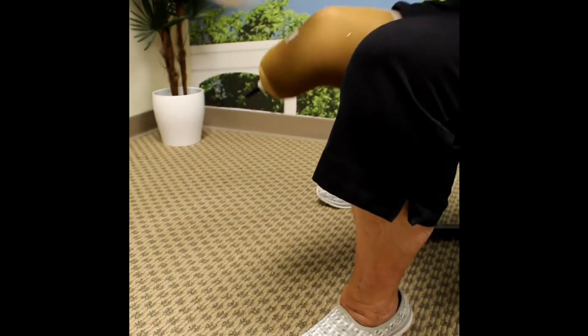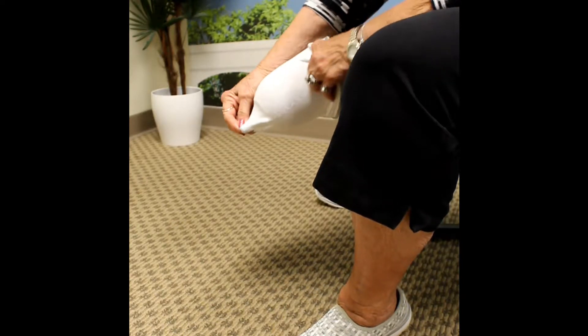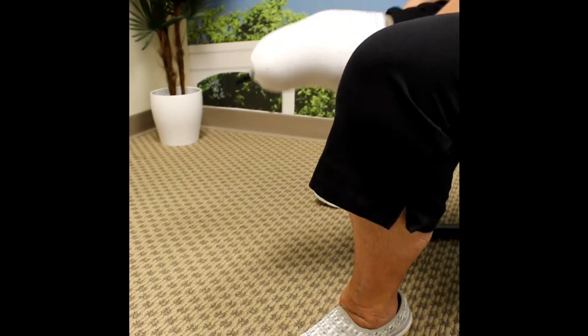To use socks, place the sock over your gel liner. Be extremely careful that the pin is completely free of any sock material and pull the sock up above your knee. Then place your limb in your prosthetic as instructed.